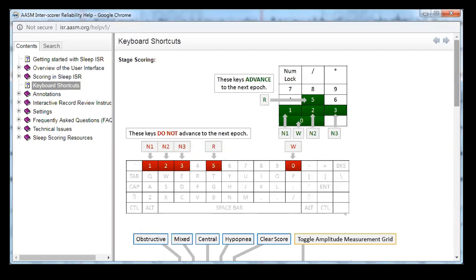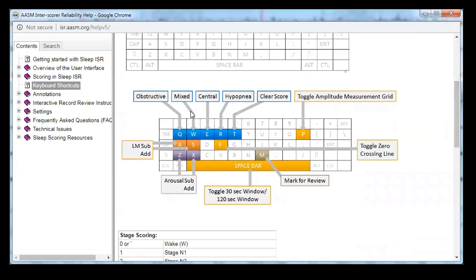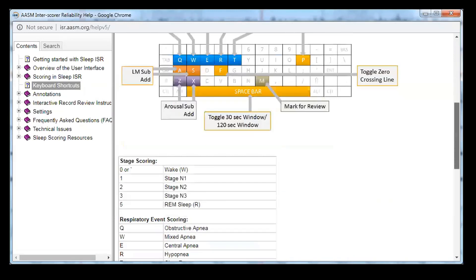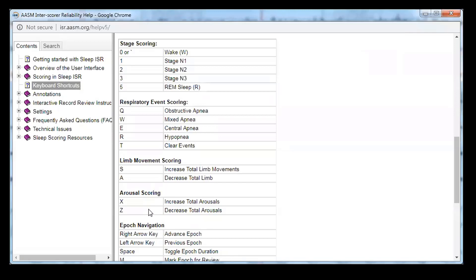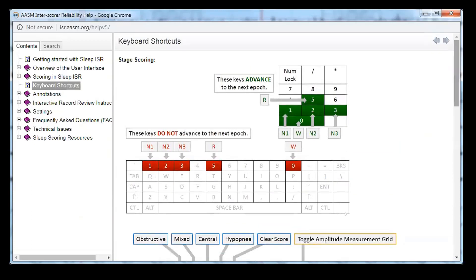If you go to the help menu, I want to show you the different buttons to push on the ISR so you know how to score it. We have four different areas we're scoring: staging, respiratory, limb movements, and arousals. For stage scoring, respiratory scoring, limb movements, and arousals — you can see the keyboard shortcuts there. Just know you can go into the help menu and look at keyboard shortcuts so you know exactly what to do when you start scoring these records.